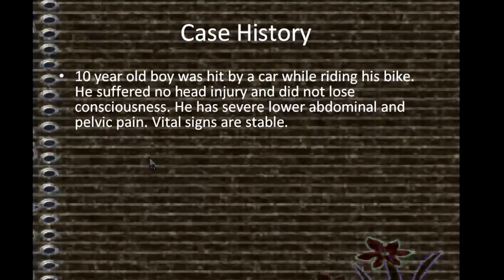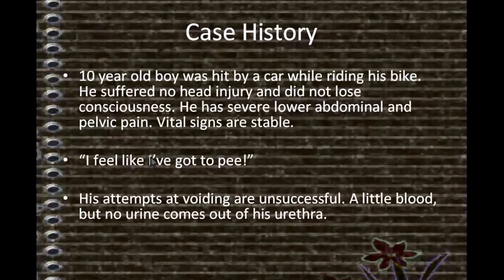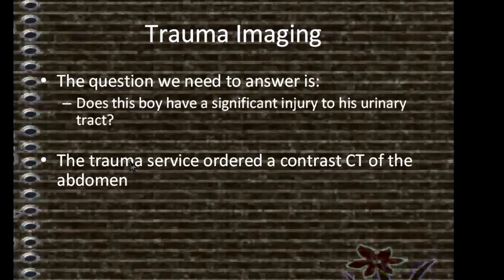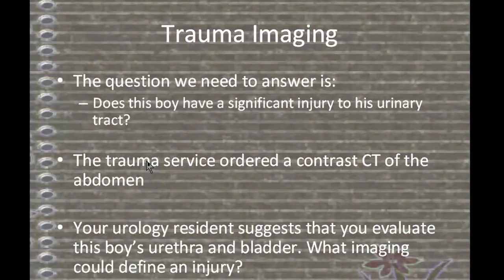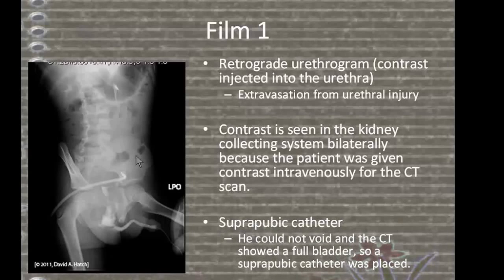Case history: a 10-year-old boy was hit by a car while riding his bike. He suffered no head injury and did not lose consciousness. He has severe lower abdominal and pelvic pain. Vital signs are stable. He feels like he needs to urinate but his attempts at voiding are unsuccessful — a little blood but no urine comes out of his urethra. Trauma imaging: the question is whether this boy has a significant injury to his urinary tract. The trauma service ordered a contrast CT of the abdomen. The urology resident suggests evaluating the urethra and bladder. Film 1: retrograde urethrogram — contrast injected into the urethra shows extravasation from a urethral injury.